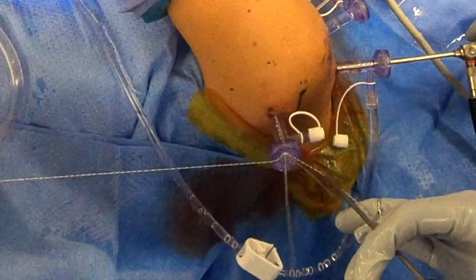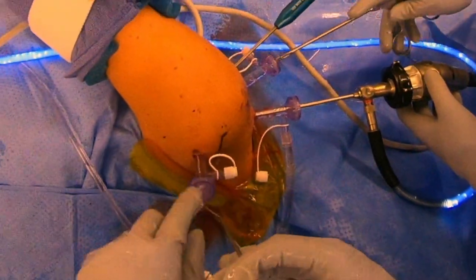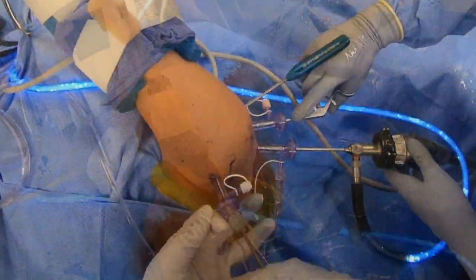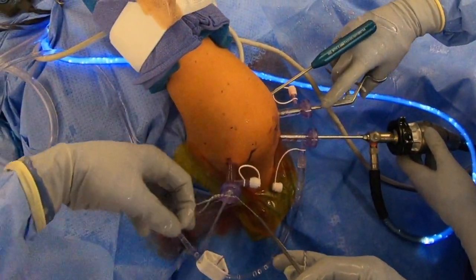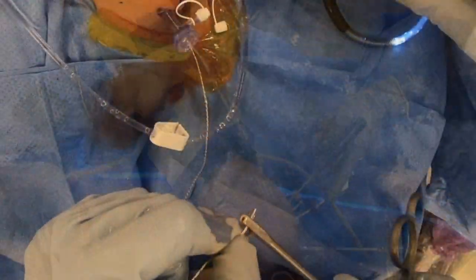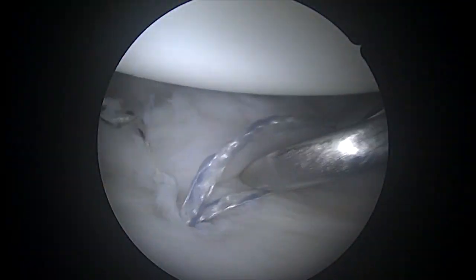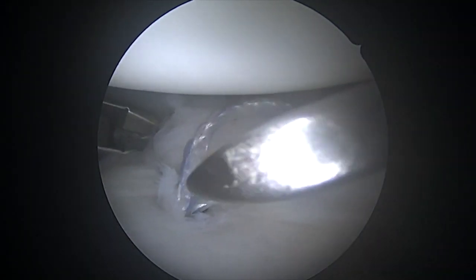This is the tying portion of the procedure. There's a special way of tying the knots outside using this knot pusher, which pushes the knots down inside the shoulder. Once all those are tied, I tie a total of seven knots to be absolutely certain it's not going anywhere. We use this cutter to cut the knot, and then we're able to grasp the other suture and move on to the next one.